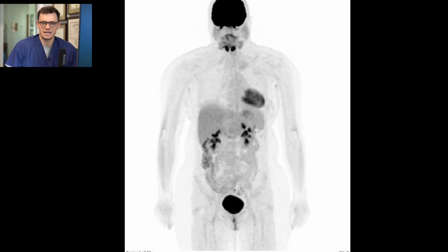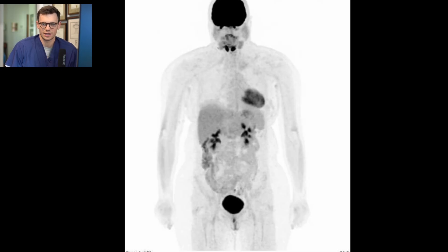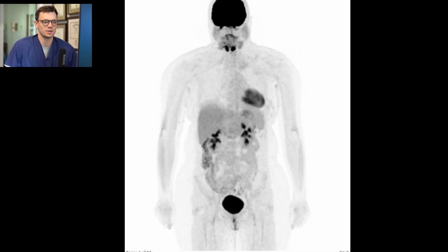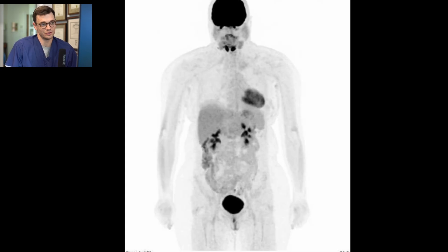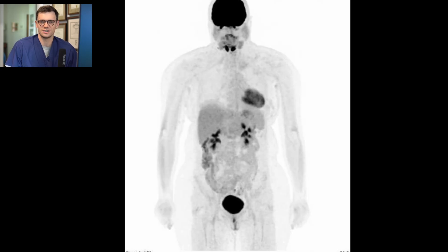Let's talk about how to approach an F18 FDG PET-CT. Of the PET-CT scans, we have different tracers now, and F18 FDG is the most common one. This tracer acts like a glucose analog and localizes to very metabolically active tissues. Cancer is very metabolically active — it's rapidly dividing more than it should be, and therefore takes up a lot of glucose. We can take advantage of that by using this tracer to localize where the cancer actually exists in the body, and that is the basis for how we do these PET-CT scans.